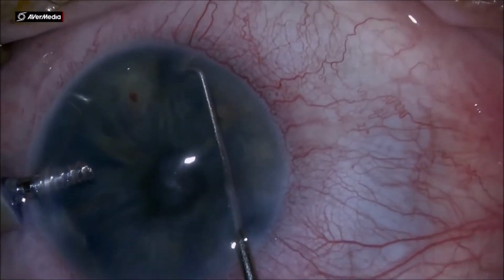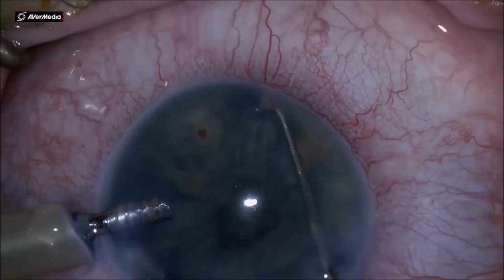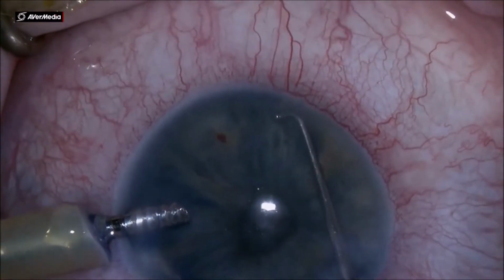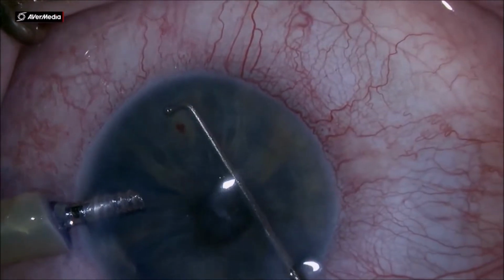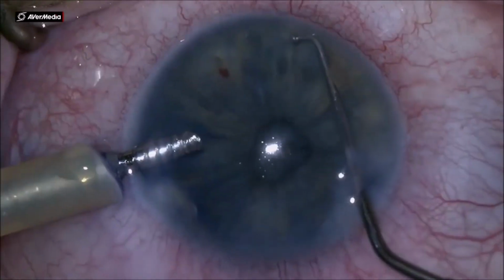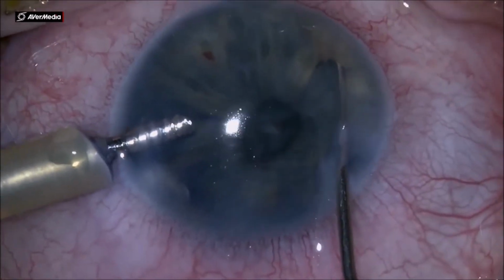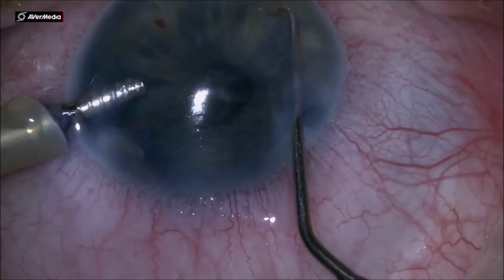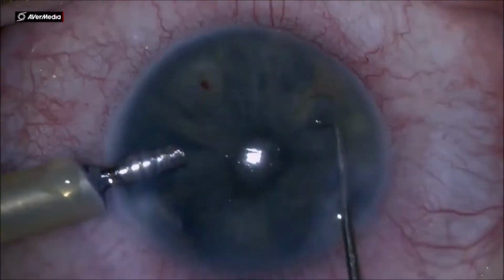persistent and strong. And I use in this case the chopper to release the anterior synechiae from the cornea, and then pushing down a little bit on the iris root to disengage the iris from the trabecular meshwork and open up the outflow of the aqueous from the eye.